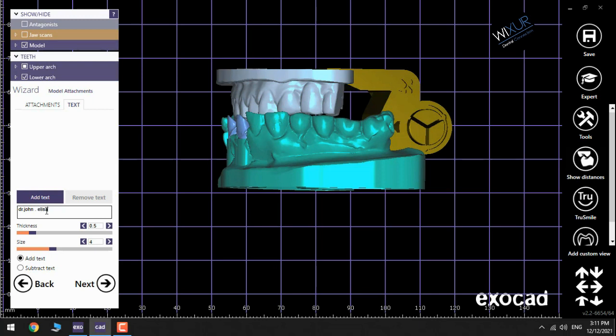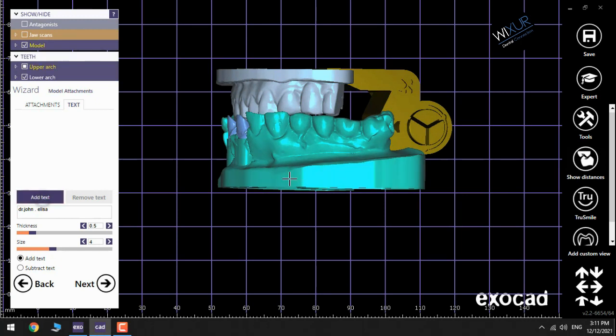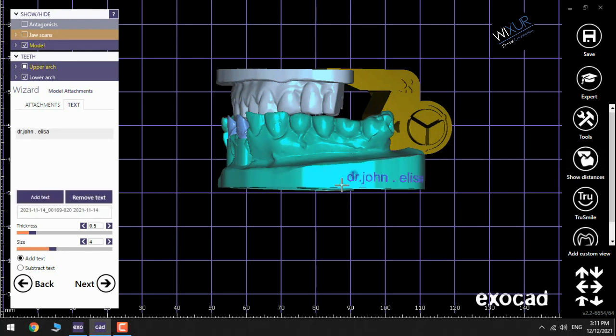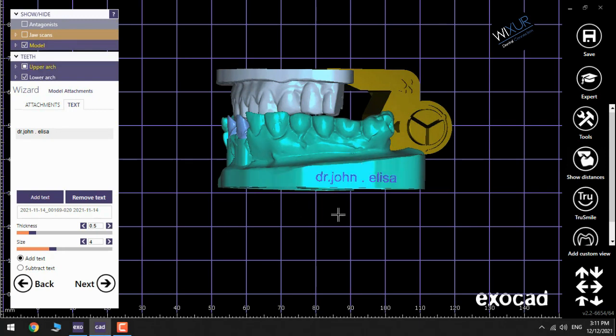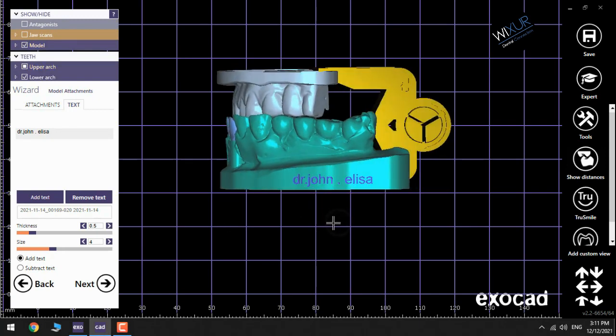Add text. Set the thickness and size of the text, how do you need it.